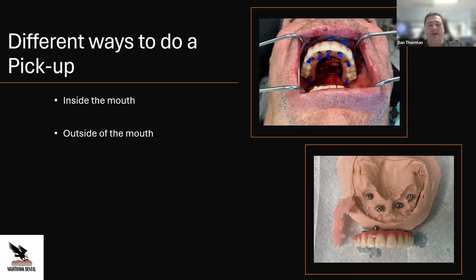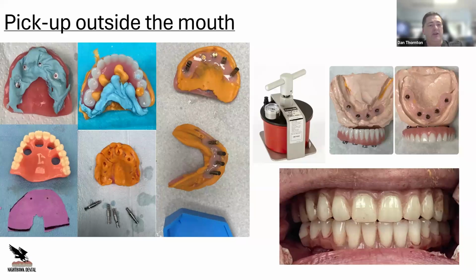Now, when you're picking it up traditional style with the freehand surgery, the way I like to do it, I'm going to step forward to give you a little better view. I like to do it with a little more bite material underneath of it. This is a lot of times when my rubber dam comes into play, just to protect the surgery area, because you can do this, and if the surgeon's okay, while the patient's tissue is still flapped open. You're just protecting that area with your rubber dam, and picking up the cover caps off the multi-unit abutments, so you know where to drill your holes.